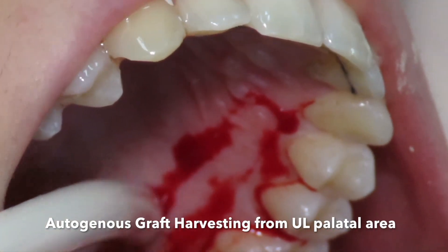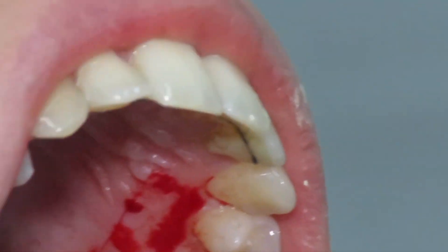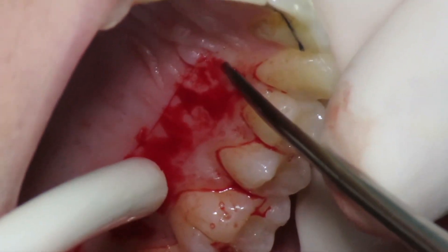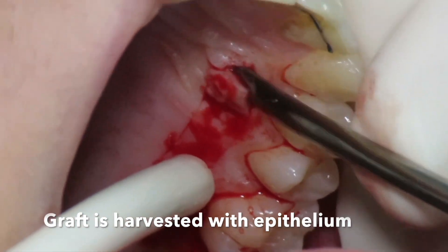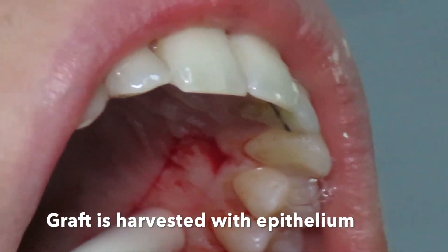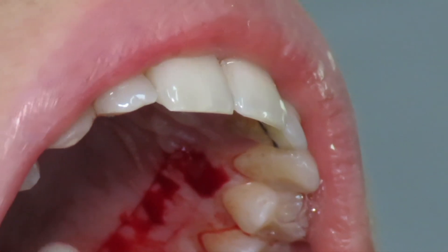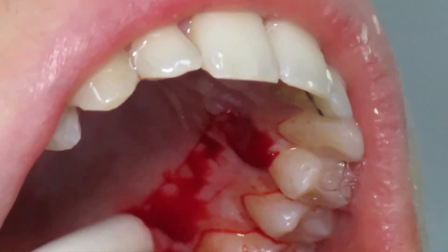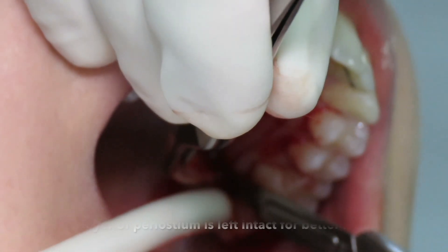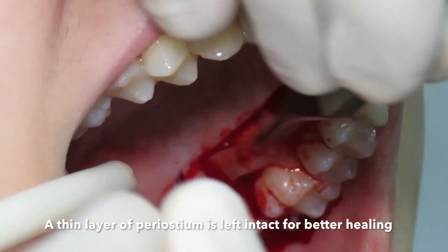We harvest a full thickness graft — meaning epithelium and connective tissue — in a technique described by Zucchelli. This is the graft harvested with epithelium. We also preserve the periosteum in the palate for better and faster healing.